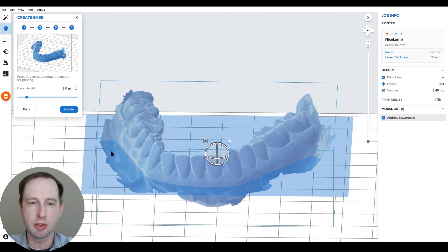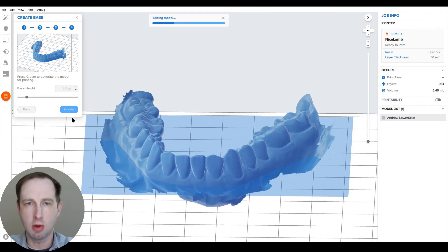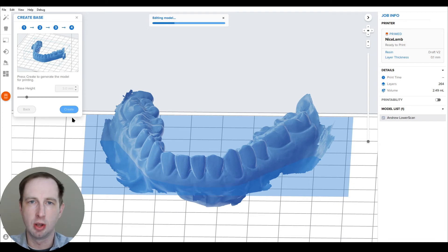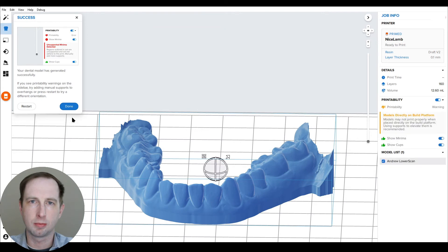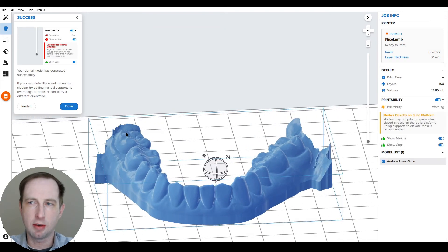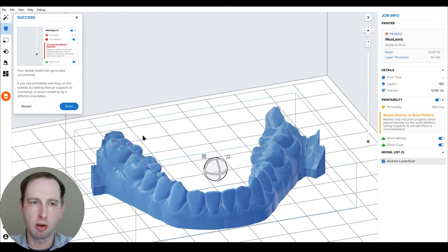For this example, I'll keep it at three and I'll hit create, and it will now cut the model and add the additional three millimeters in base. Now we have our built and complete model.